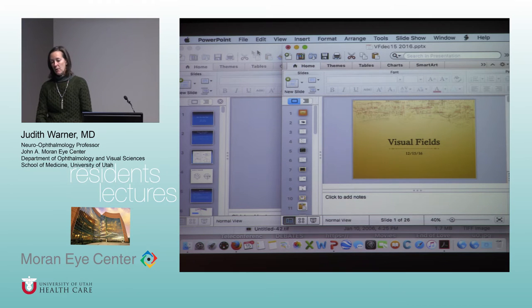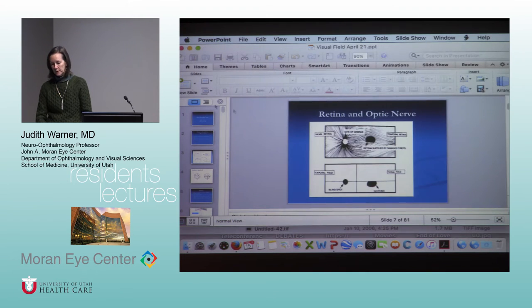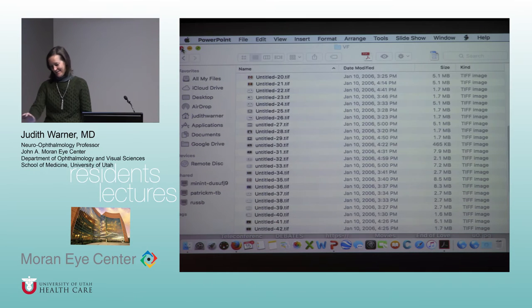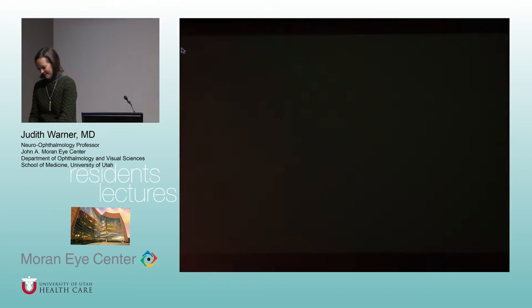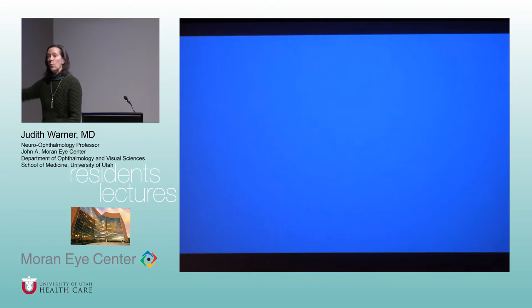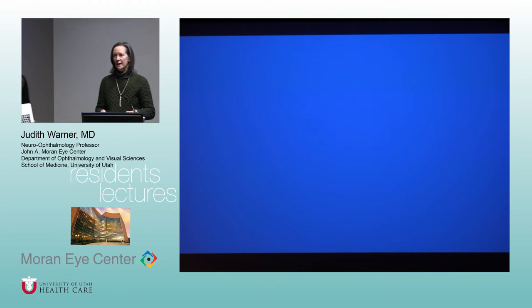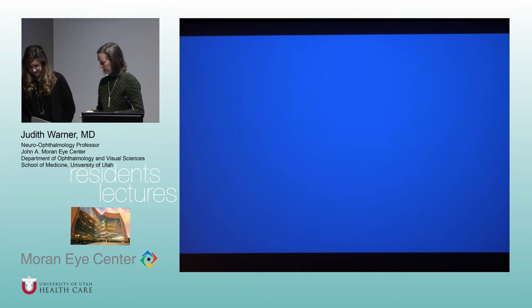Not demonstrated on Humphrey visual field testing. Okay. That's pretty good. Is it not demonstrated on Humphrey just because it doesn't go out far enough? Because you can see it's way the heck out there. That's like at 60 to 80 degrees. Mm. But the patients may say, "Well, I think I can see something out here," and you try and get a stimulus into there, and it's hard because it's way the heck out there, and they can't really read with it or anything.